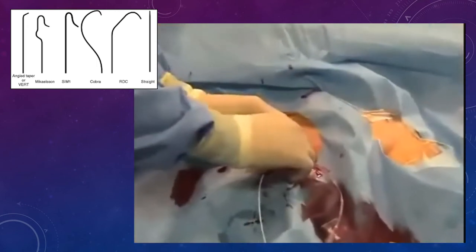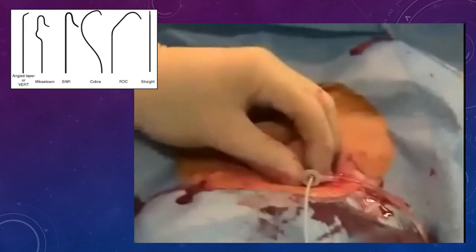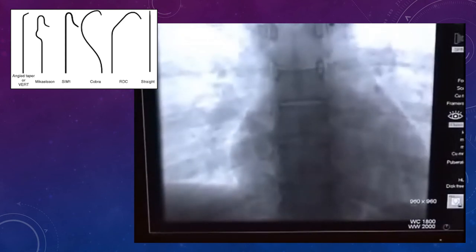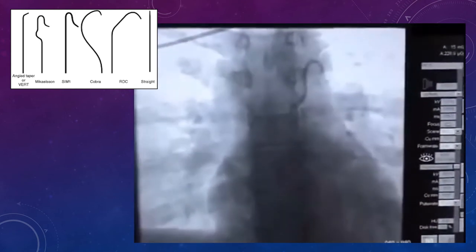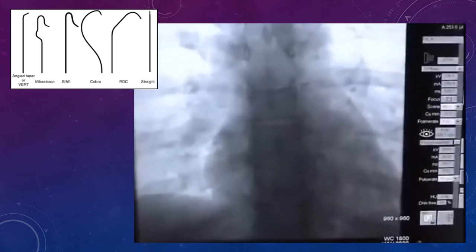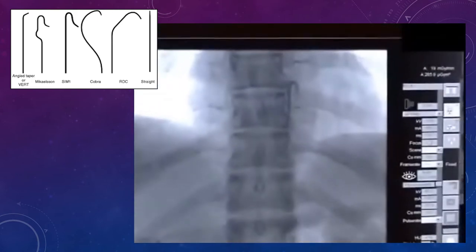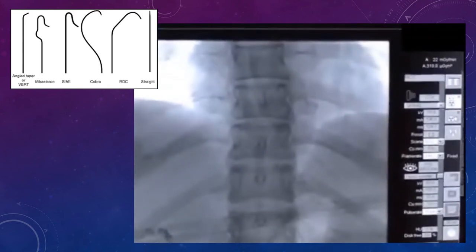The catheter tip is now inserted into a sheath which sits in the right common femoral artery. All work is done through this sheath. The catheter is advanced and now X-rays are used to guide the doctor. Here the catheter is being advanced in the aorta and we can see the vertebral bodies and the ribs. The catheter will be gradually positioned in the aorta and the doctor begins to place the tip of the catheter into individual spinal radicular arteries.